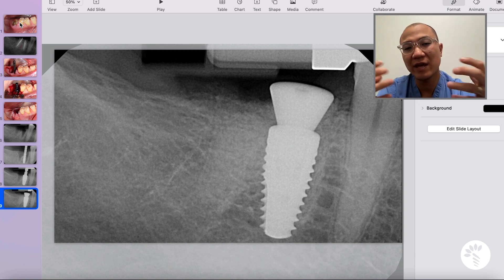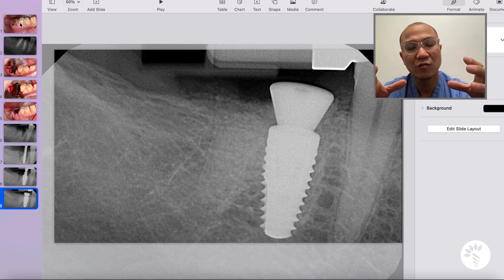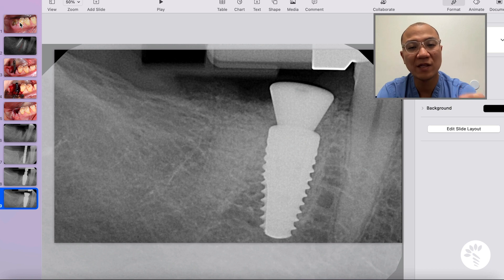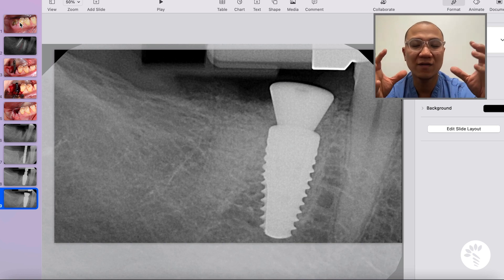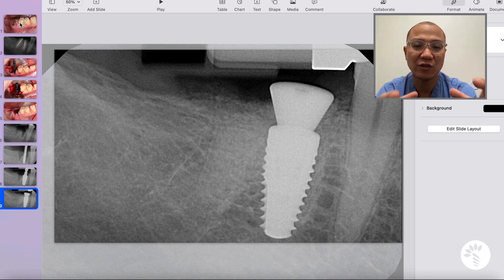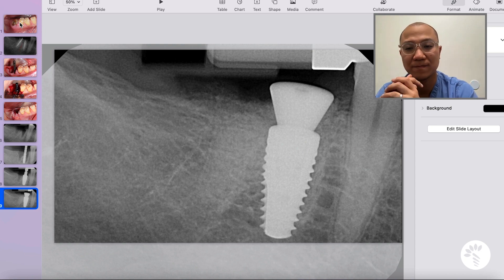Another thing that is really important in this case: when you are thinking about doing an immediate implant, you want to make sure that you do not traumatize the hard and soft tissue during the extraction. The extraction has to be done in a very atraumatic way to preserve the soft and hard tissue architecture.